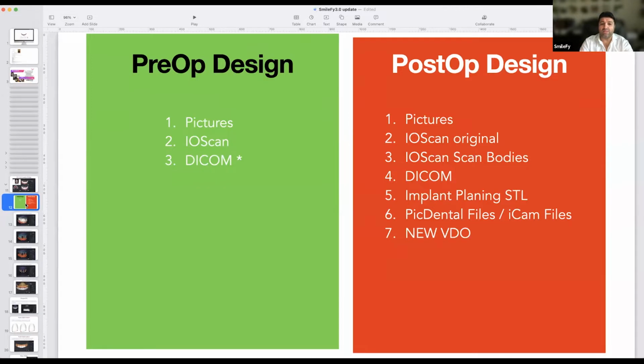Why? Because we see the situation of the patient. We need to start somewhere, and based on the first design bring new data, new diagnostics, and then build up the treatment plan based on everything we have. But first of all, the most important thing, and the basic philosophy of facially driven smile design, is that we start with the face.